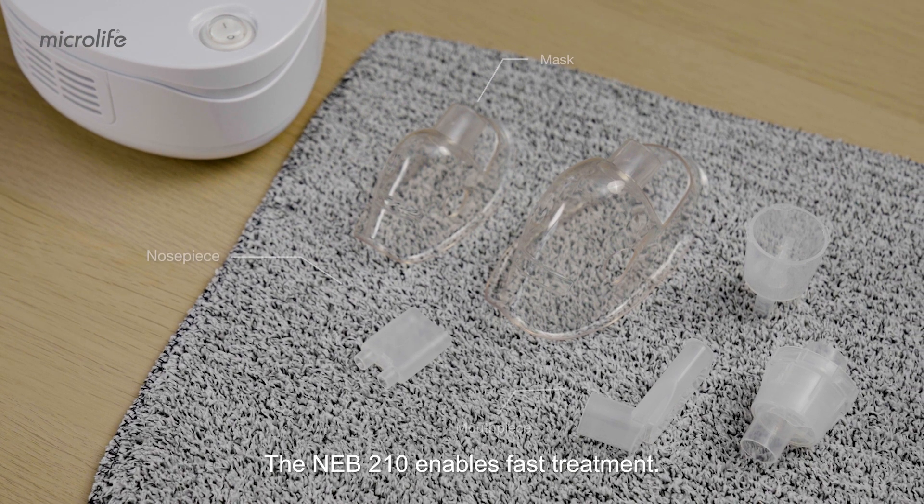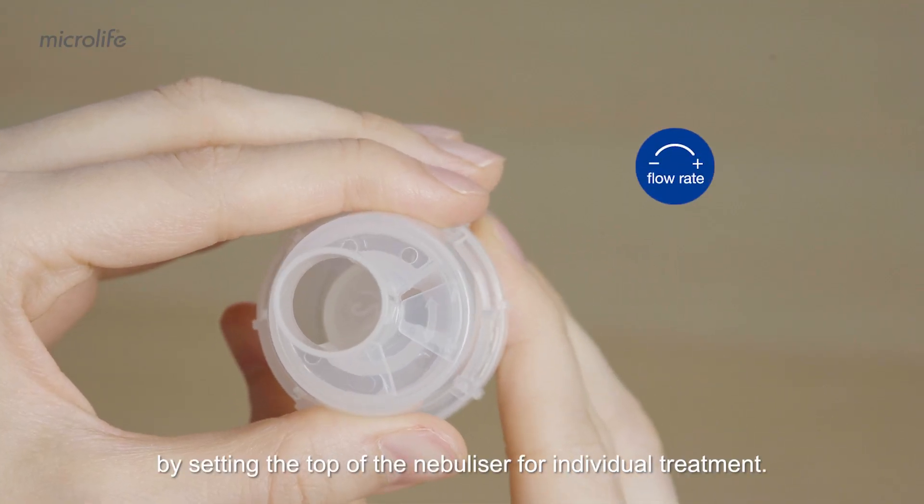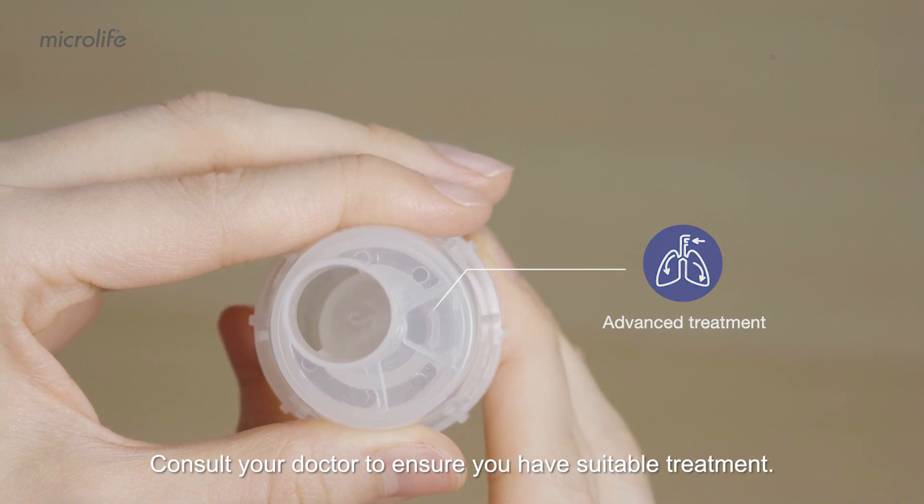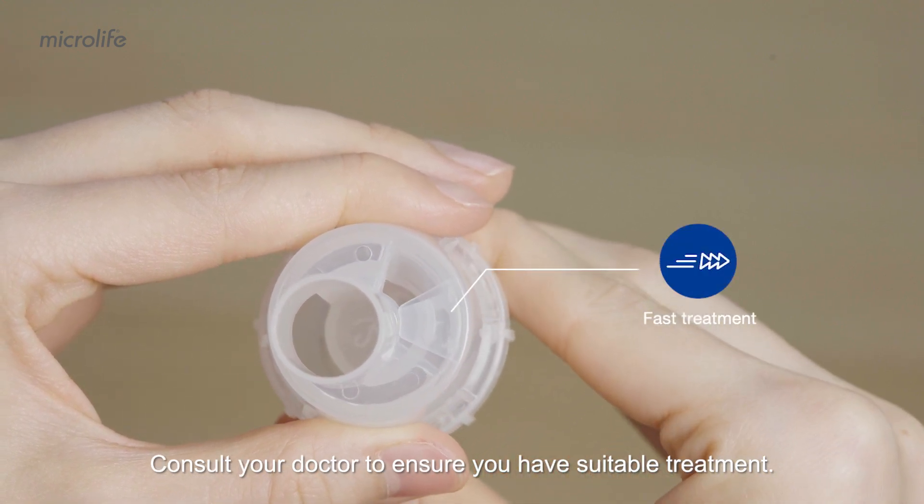The NEB 210 enables fast treatment. The mouthpiece gives better medication delivery to the lower airways, while the nose piece provides efficient treatment to the upper airways. The flow rate can be adjusted by setting the top of the nebulizer for individual treatment. Consult your doctor to ensure you have suitable treatment.